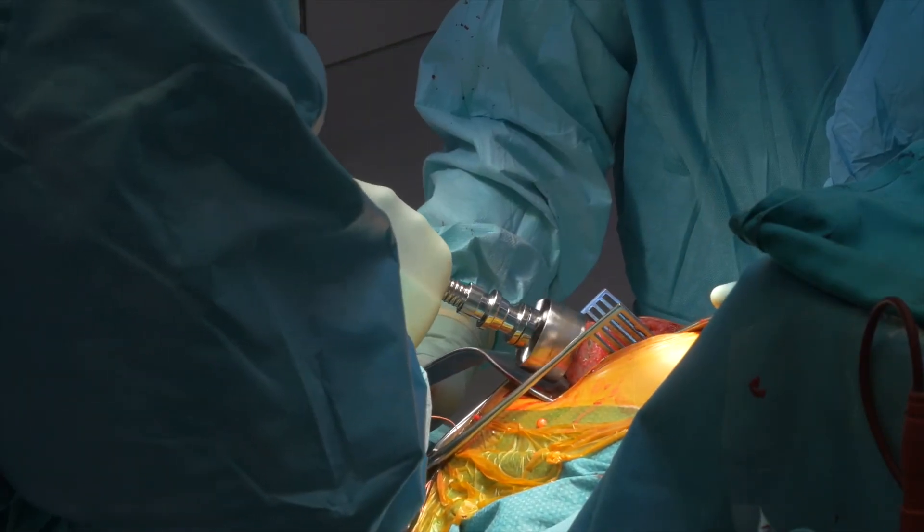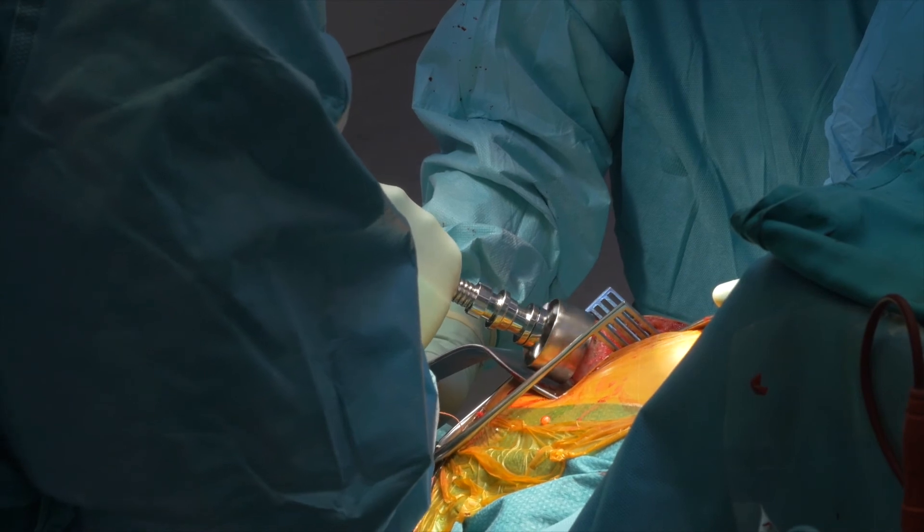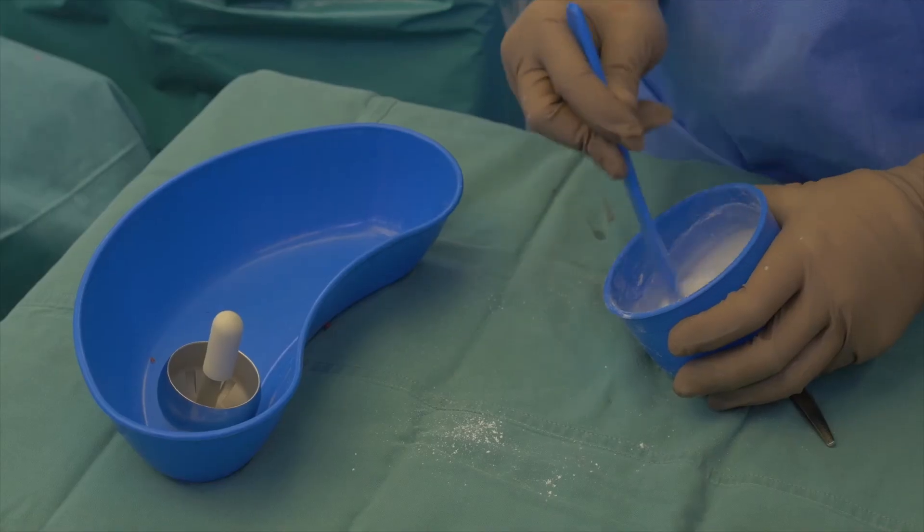In the second part of the operation, the arthritic femoral head is profiled to accommodate the new resurfacing and it is cemented into position.